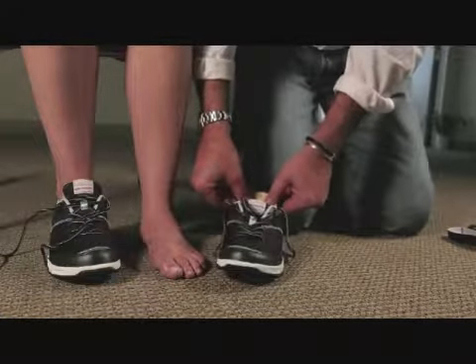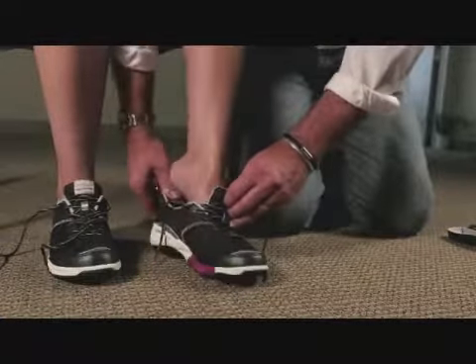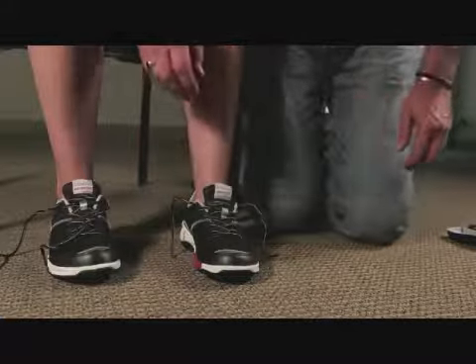Pushing down firmly with both thumbs into the back to make sure it sits square. Place the foot into the shoe — this foot has no sock on it. There's no heat transfer from the base of the orthotic through to the dorsal surface, so it's quite safe to do so.